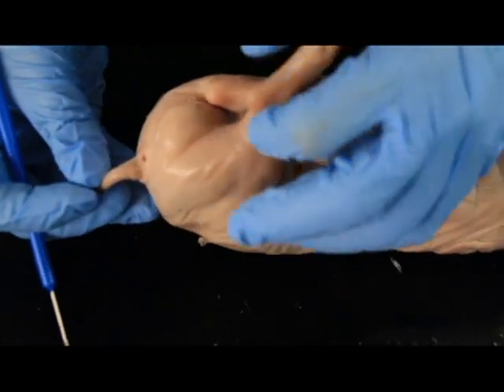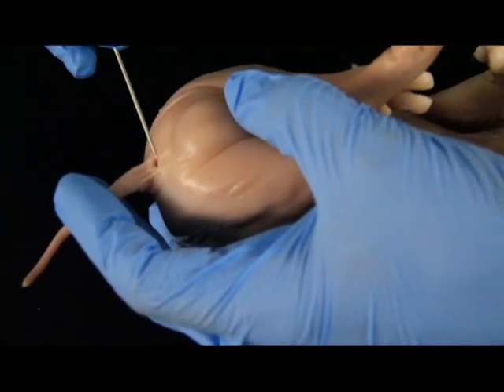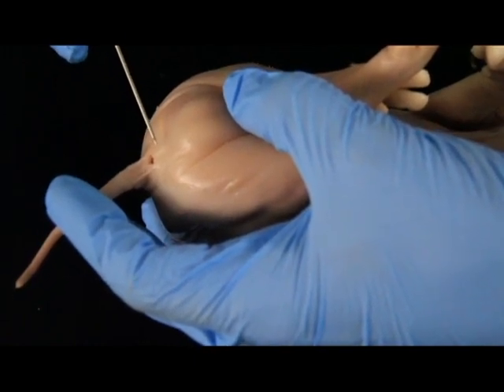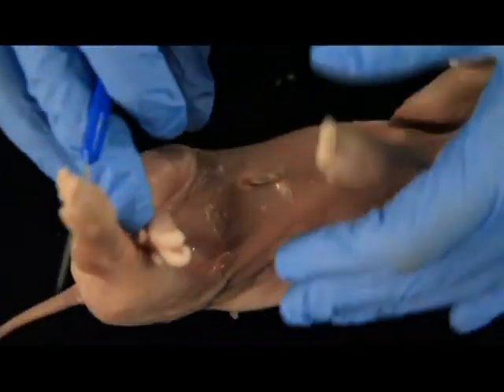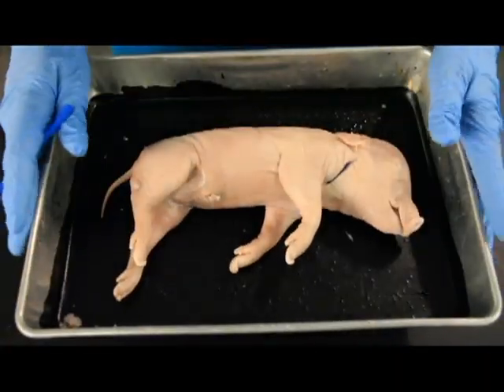If it was a female, if we looked right here underneath the tail, right below the anus, there would be a small bump right here. That small bump is known as a genital papilla, or genital covering her urogenital opening. So again, the genital papilla would be this little bump right here, and her urogenital opening would not be up here, it would actually be back here. So let's go ahead and look at a female so we know what that looks like.